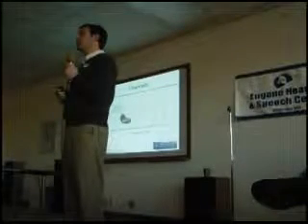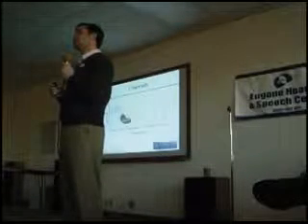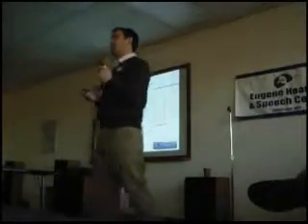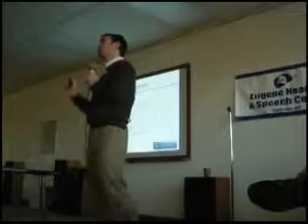Because your clinician may say, you know what, for what you told me your lifestyle is, I think the one that has 10 channels is going to do the job really well, even though there may be one that has 20 channels. It all comes back to that relationship you have with the clinician. But it's more important than you think.